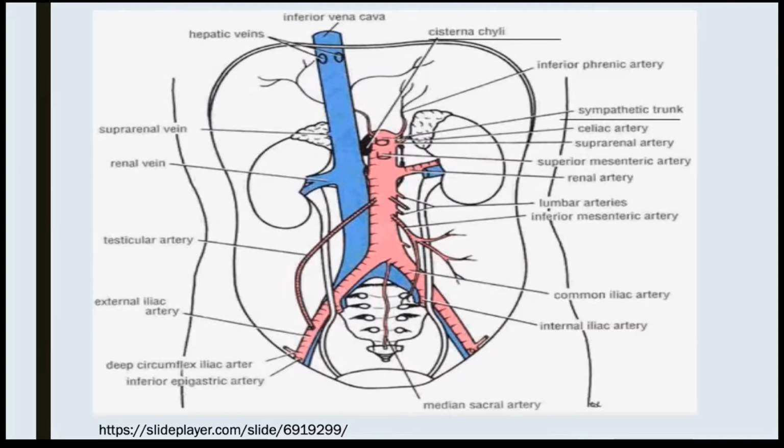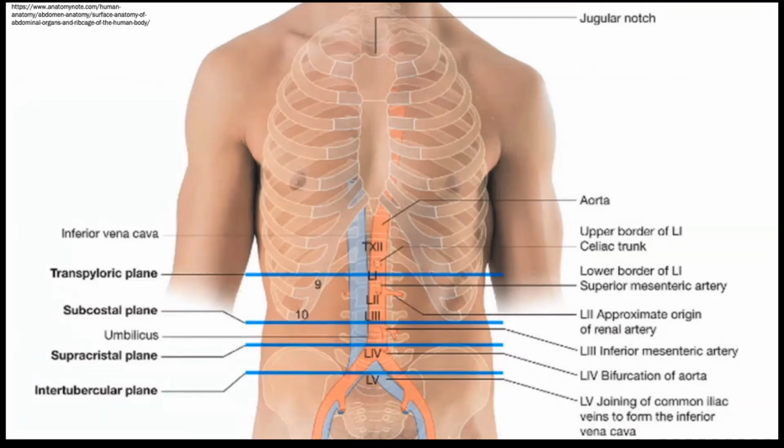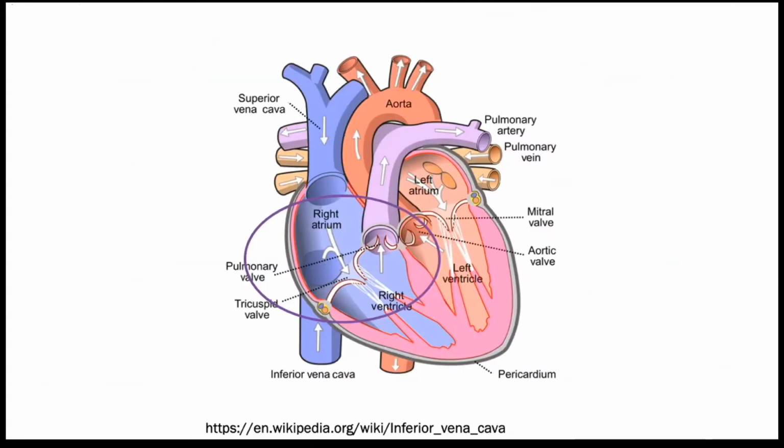It's long and big, and it's the biggest vein in the body. There we go. Superficially, that's where you're going to find it, like Priya showed, why we put the probe there, because that's the surface anatomy, and that's where you're going to look for it. And that's the interaction we're looking for, the IVC going into the right atrium and then giving us feedback directly to the heart.